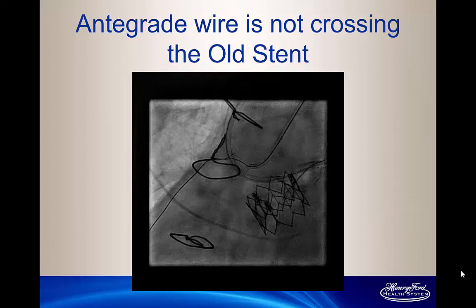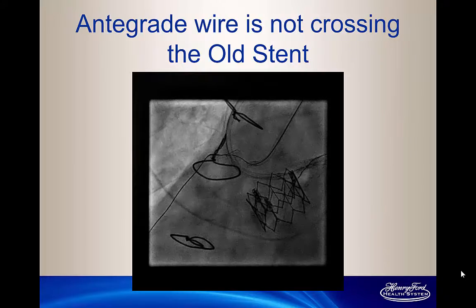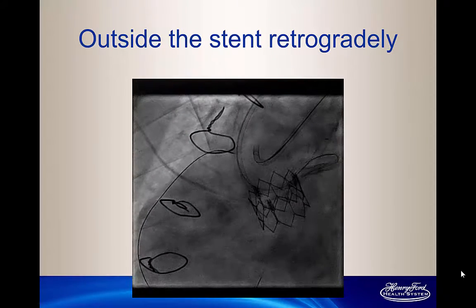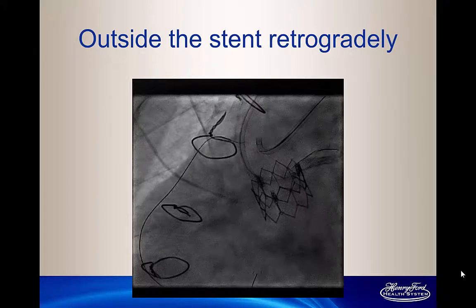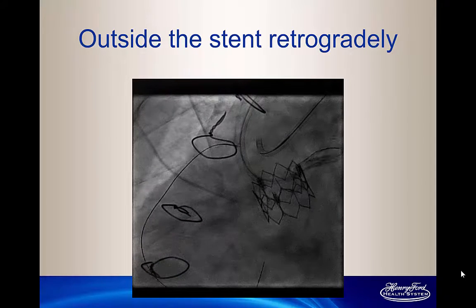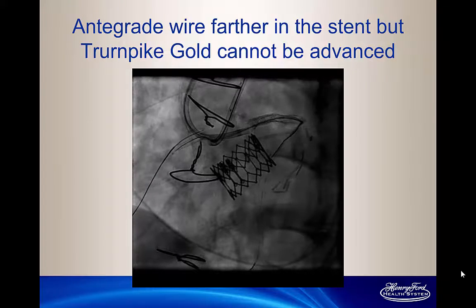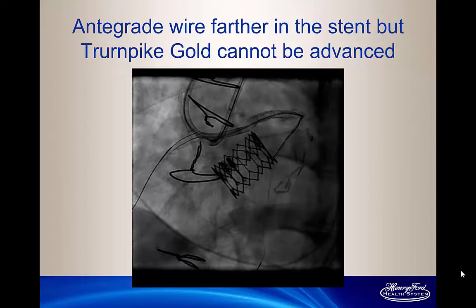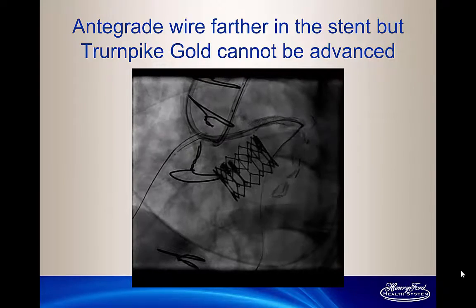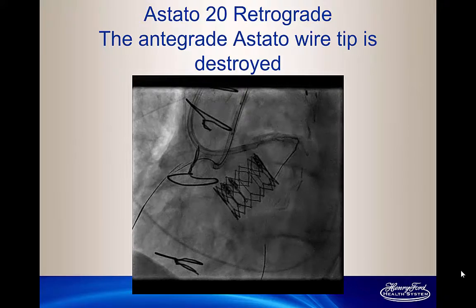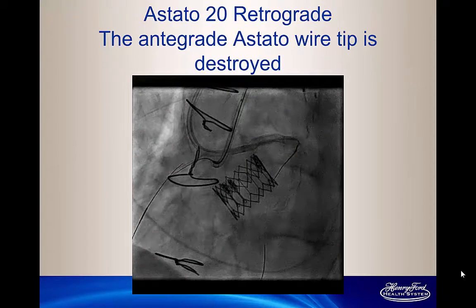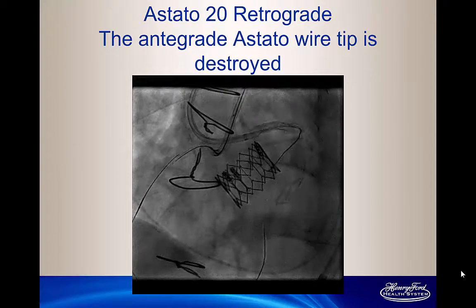We finally decided to go outside the stent retrograde, trying another very supportive wire. I actually tried a Stingray wire antegrade, and it went farther, but I could not do anything with it. Trying retrograde again, the wire was still going outside the stent but now from the inferior aspect. I tried the Stingray wire again — it went farther, but I could not advance anything behind the wire to get through the stent. The tip of the Stingray wire was damaged. This is a 20-gram wire trying to puncture through, with the Turnpike Gold behind it, and it would not go.